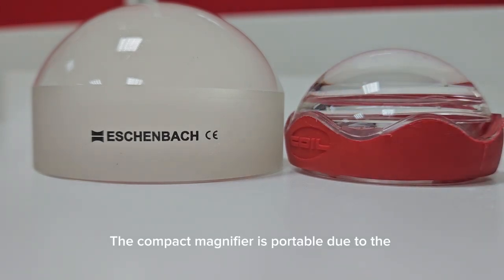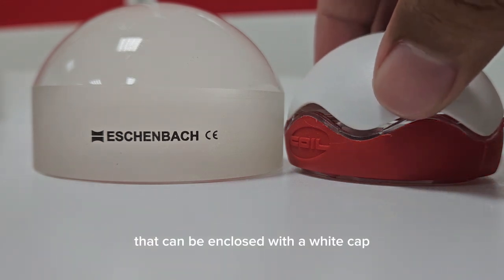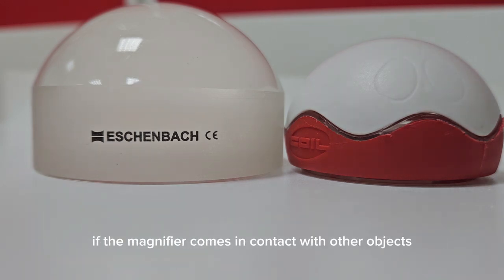The compact magnifier is portable due to the size being smaller and the weight being lighter. Note that the portable dome magnifier has a red plastic mount that can be enclosed with a white cap, which is vital to prevent any scratches or cracks from occurring if the magnifier comes in contact with other objects.